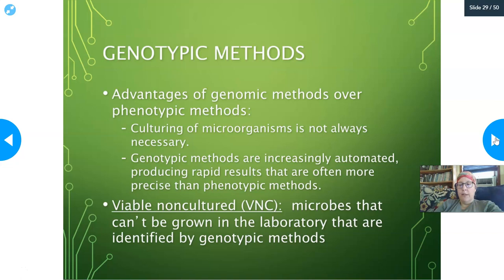There's a couple of videos I have linked that I really want you to check out. One of them is the BioFire FilmArray. One of the cool things about the BioFire is that they're present in labs that are local right now. They're all over this region and they're being increasingly used. What you can do is with one test, you can test for a whole bunch of stuff. Usually it's system specific. So they have a respiratory one and a GI one. And for the respiratory one, they can check for everything that can cause different respiratory infections.